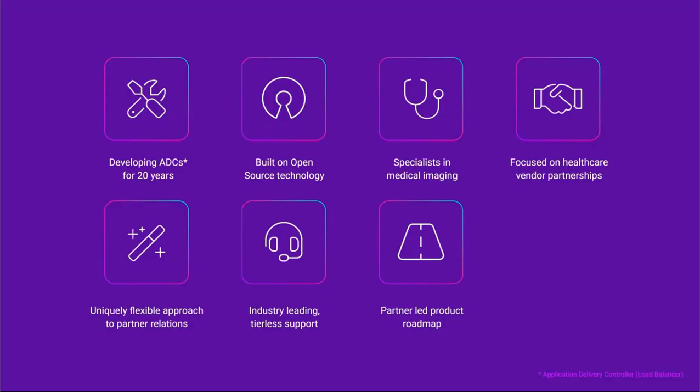Finally, a point to touch on is that our product roadmap is largely driven by the requirements of our healthcare partners. This has not only helped to create a product optimized for enterprise imaging environments, but also we have built in the flexibility to align software releases with your product roadmap as well.